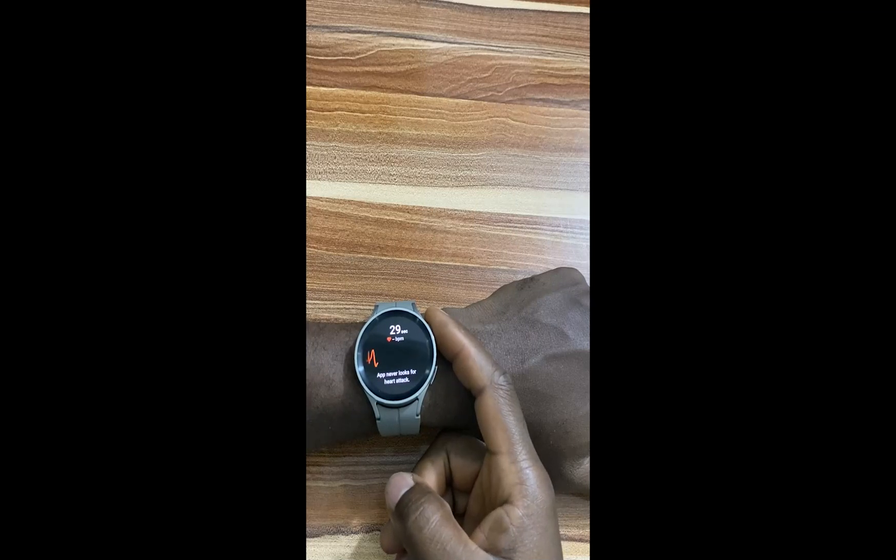Hello everyone, it's Judy and you're welcome to Smartwatch Series. In this video, I'm going to show you how to get ECG and blood pressure measurement features on your Galaxy Watch 5 and Galaxy Watch 5 Pro. Like the Galaxy Watch 4 and Galaxy Watch 4 Classic, the Galaxy Watch 5 and Galaxy Watch 5 Pro also have ECG and blood pressure measurement features.